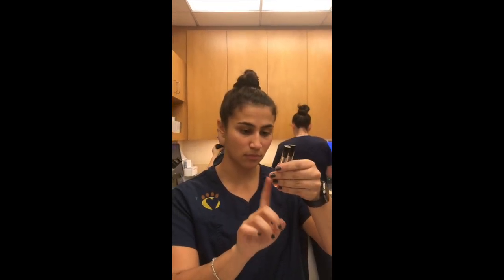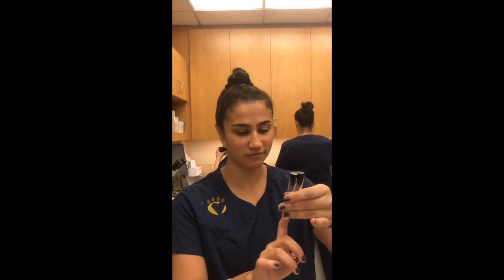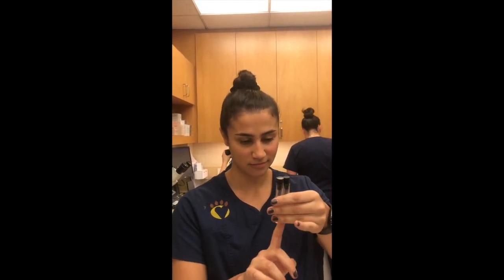Actually, I'm not getting any agglutination, so that's good. So then no agglutination in our controls.